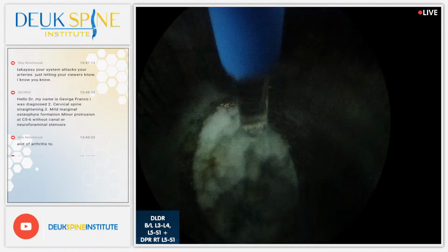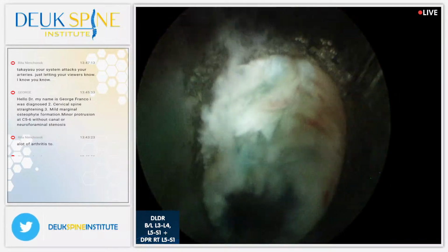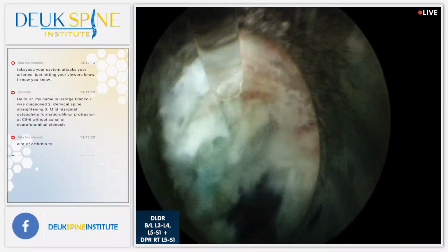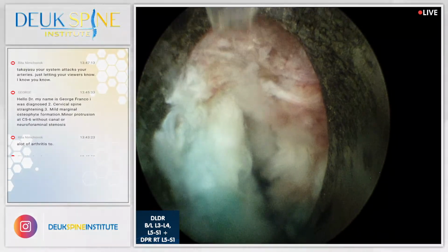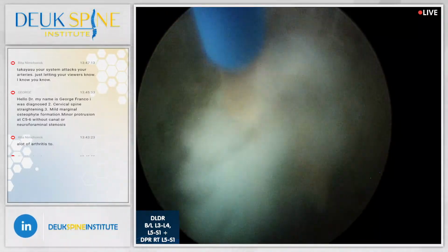And that's because in a lifetime, people tend to herniate a lot. Okay, look at that. You guys can see the tear quite nicely. You see the annular fibers coming off the end plate right there. That pinkish stuff, that's bone right there. You guys see the bone, the smooth, kind of weird surface? Yes, we do. And then you got all this inflammation going on that's associated with the tear.